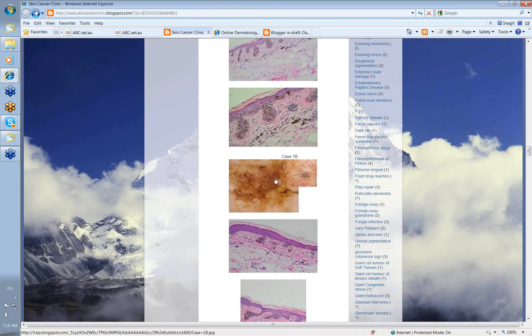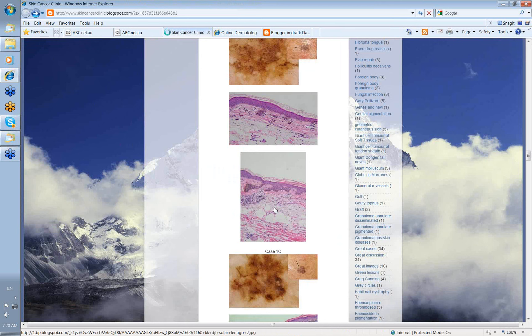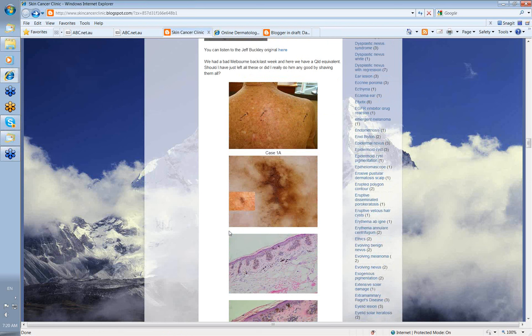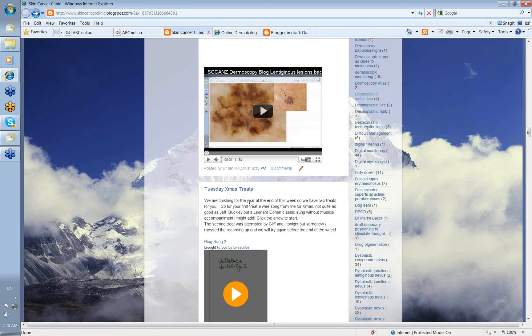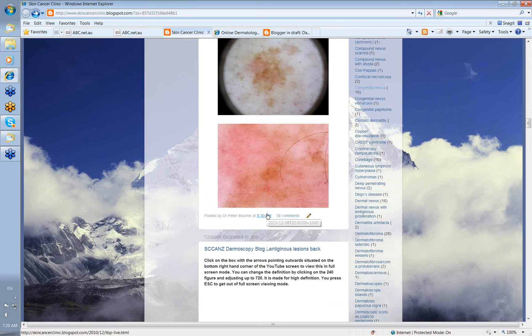The middle lesion showed curved lines and grey dots scattered through it, indicating regression within a solar lentigo. We have the histology of that as well, with the typical 'dirty feet' increase in melanin and sometimes some melanocytes at the base of the epidermis. We're able to show the histology, discuss it amongst ourselves — the cumulative experience of ten authors sharing the best cases they're seeing with the 300-odd other people who have blog access.